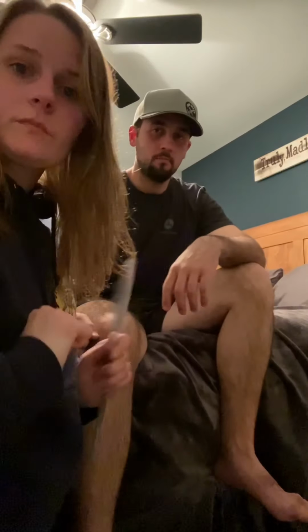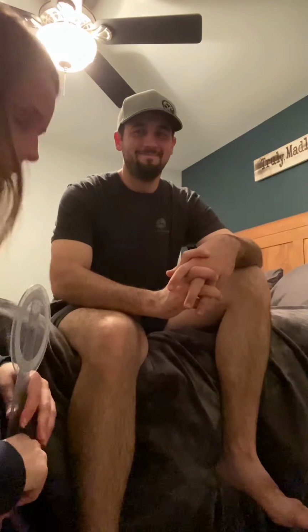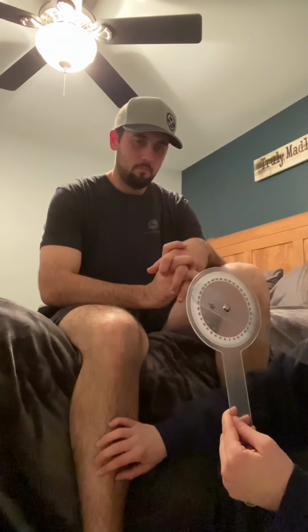So for this video, we are going to do hip internal and external rotation with the goni. This is a super weird angle because of how our bedroom is, but he has the towel roll under his leg, and I am going to come on this side first. Our fulcrum is going to be at the patella. Our stationary arm is going to be perpendicular to the floor, and our moving arm is going to be along the anterior crest of the tibia.